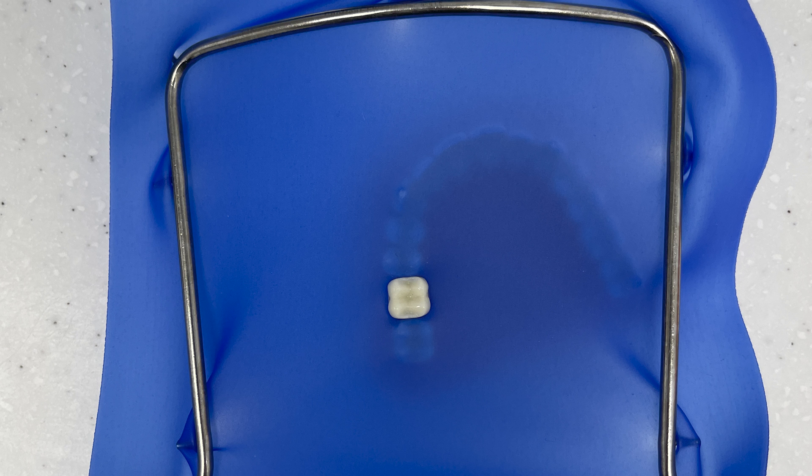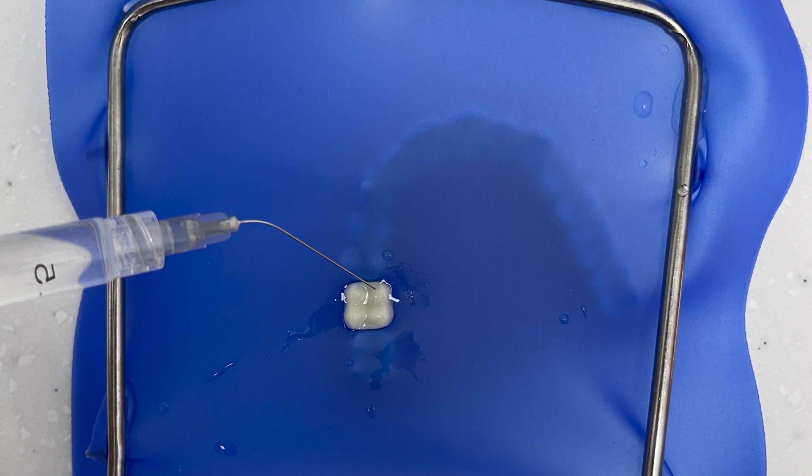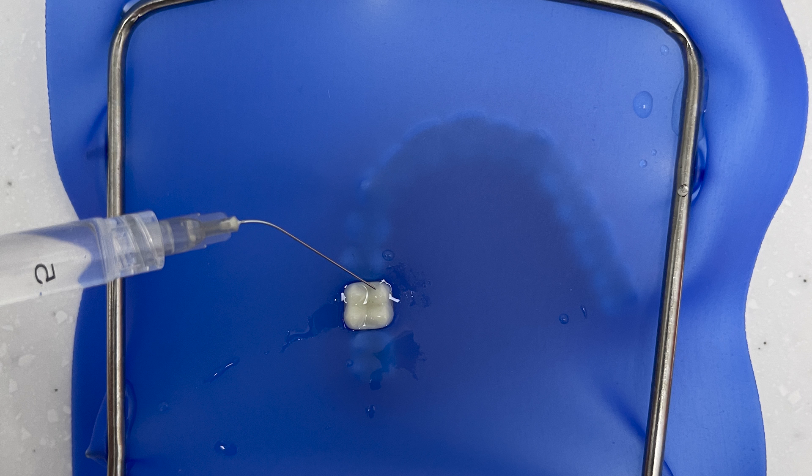Get your rubber dam sheet and punch a single hole. Ask your nurse to boil the kettle and get some near-boiling water and put it in a syringe. Isolate a single tooth and syringe some of this near-boiling water onto it. If the pulp is irreversibly inflamed, this will be very painful for the patient. Do this one tooth at a time in the area where the patient is generally feeling the pain.